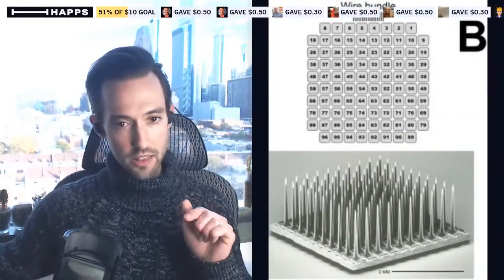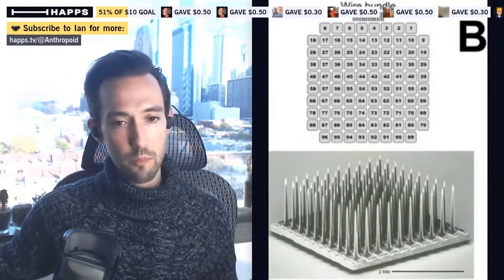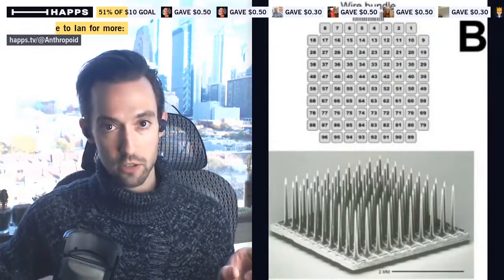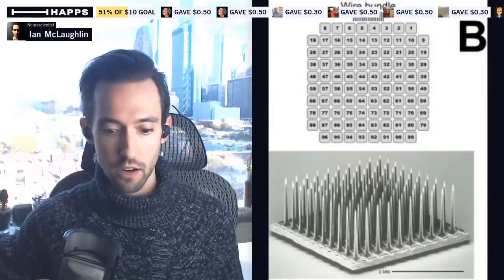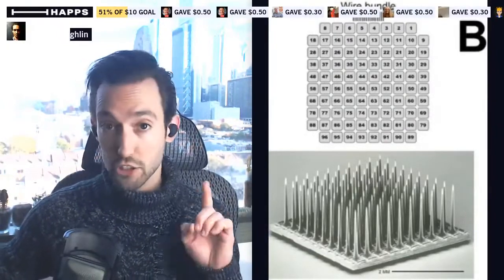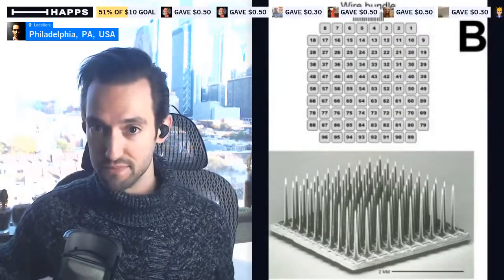Here, I should have brought this to your attention. Do you see that? So that's the implant. Again, that's the microelectrode array. At the bottom of that image, you can see this black line. That line is to indicate what 2 millimeters looks like, right? So this is very zoomed in on the implant. It would be really minuscule. 2 millimeters is quite small. And she had just one of them. So imagine implanting significantly more of them.